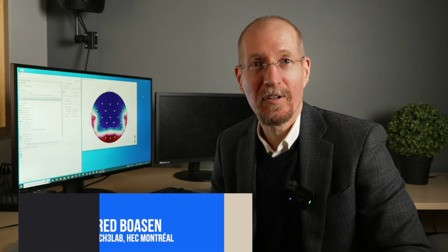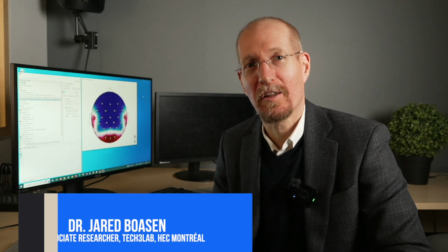I'm Dr. Jared Boasen. I'm a guest research associate here at the Tech3lab at HEC Montreal. This video is going to be about EEG analysis. And what you're going to see from now on is a specific kind of analysis to look at frequency bands.